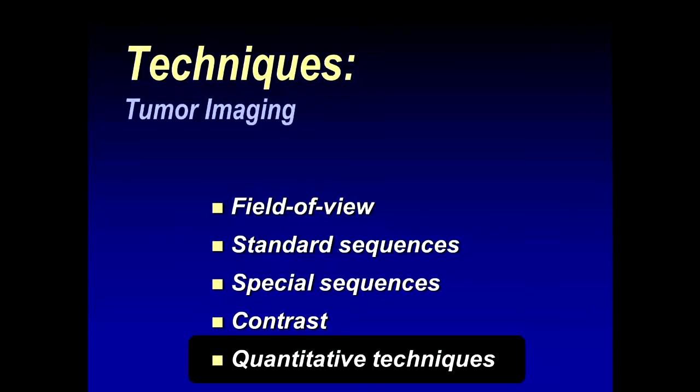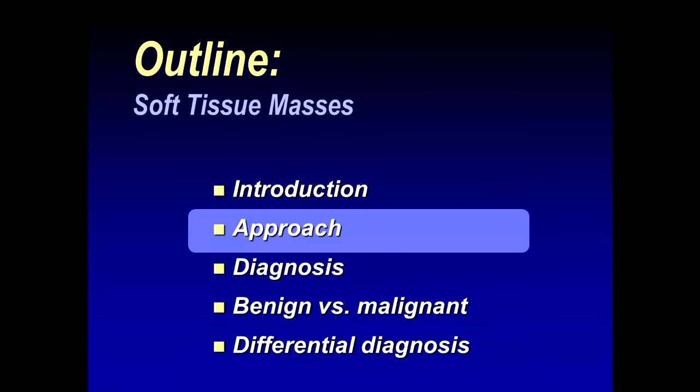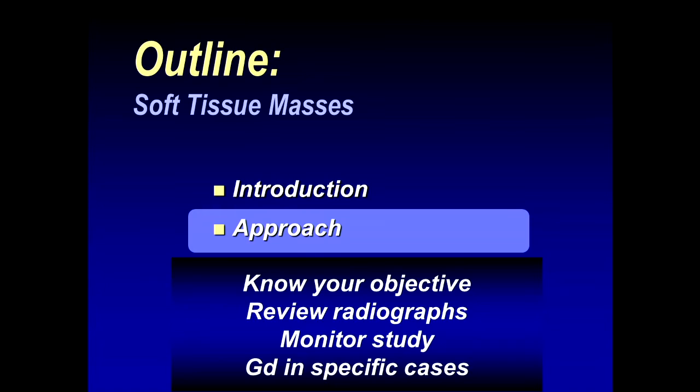Now, we won't talk about the quantitative techniques because they're generally often in special circumstances, but there certainly are a whole number of additional quantitative techniques that we can use to both measure and quantify various features that may allow us or help us to make specific diagnoses. And we'll save that for a different session. So our approach, what I can say is know the objectives of your exam, review the radiographs, monitor the study, and gadolinium can be extremely helpful, particularly in biopsy planning and surgical planning.